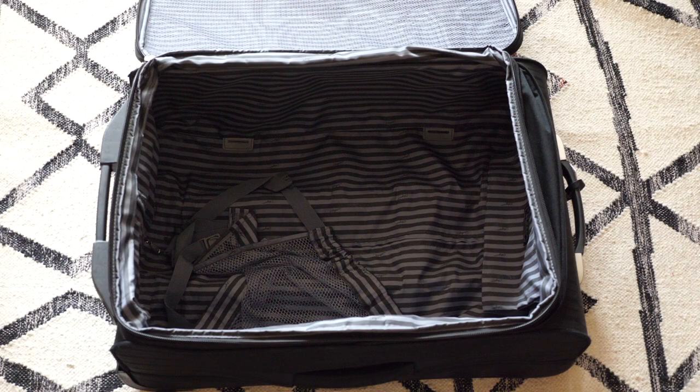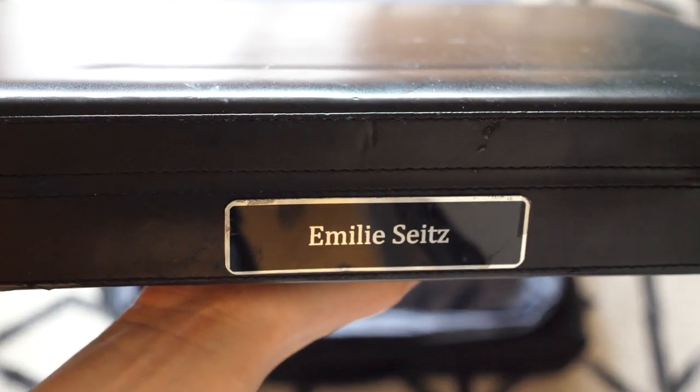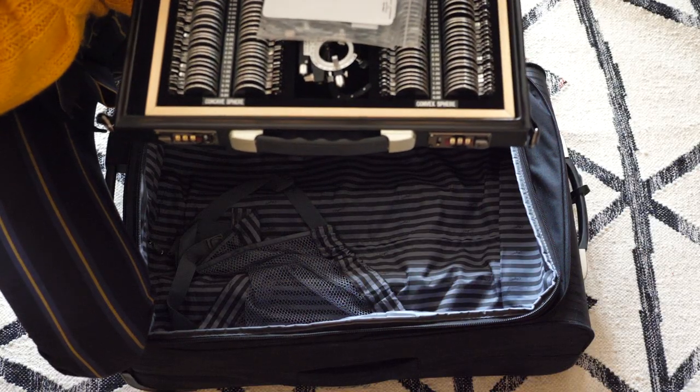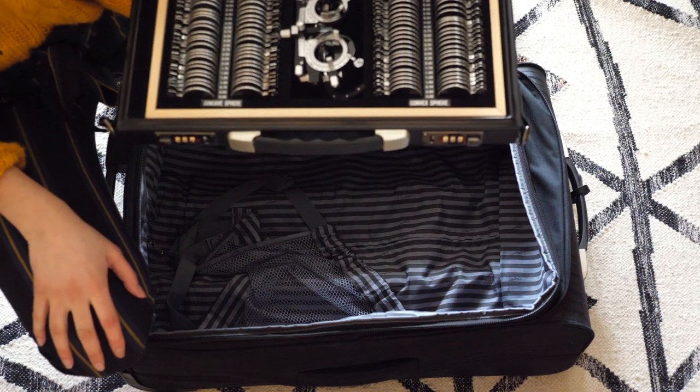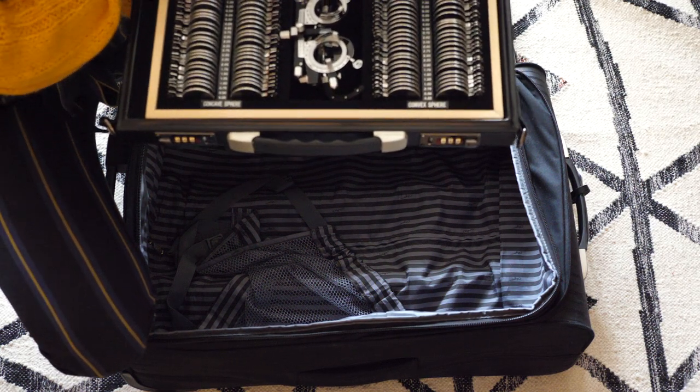It's easier to pack everything into a medium-sized suitcase rather than haul a bunch of individual items and bags. The first thing I'll pack is my trial lens kit — it is the compact version. I do have more lenses at home, but my advice is honestly just buy the compact. I never find myself needing more than just the minimum amount.